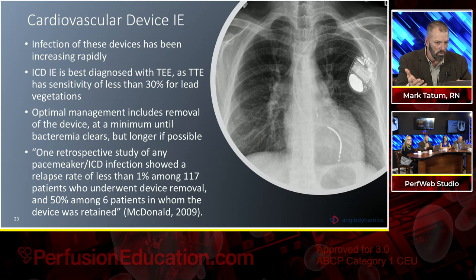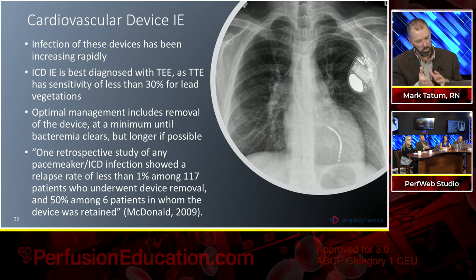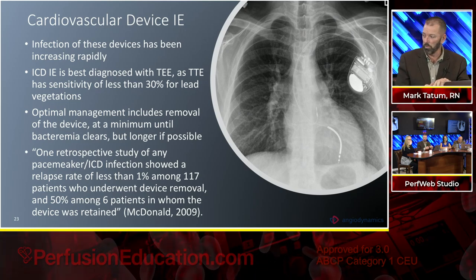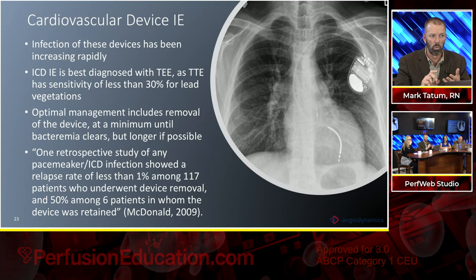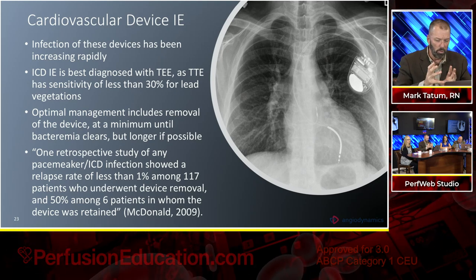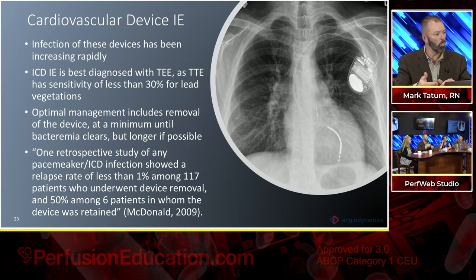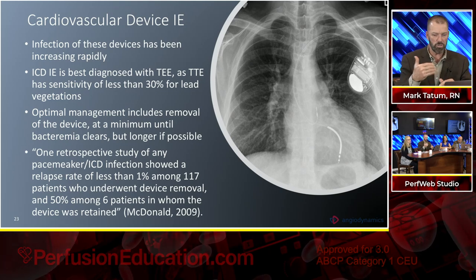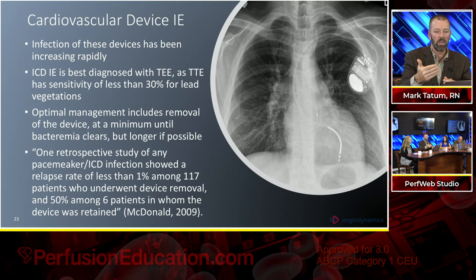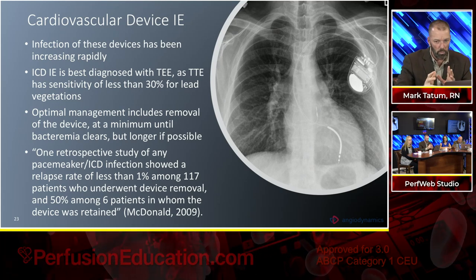When you look at this material, because it's infectious, we talked a little bit earlier in our tricuspid section about embolization of material and the possibility of septic pulmonary emboli or a pulmonary abscess. When you do a pull and pray, the problem is that the issue doesn't show up while they're on the table. The issue shows up 3, 6, 9, 12 months later, where their mortality rate is going to show up as high in some papers as 20 to 30%.